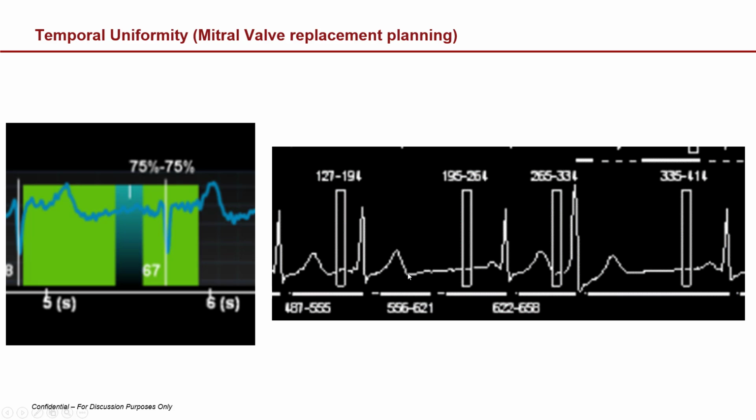And then here, look how much longer the heart had to fill with contrast and blood. So it's much larger here compared to here. And then even here, it's actually taking a systole and putting it in a diastole. So we have a systole plus a diastole plus a systole plus a diastole. That's going to give you all sorts of artifacts. And the wide detector system doesn't really matter if this happens, right? Because you're only taking it from one heartbeat, whether it's slow or fast.